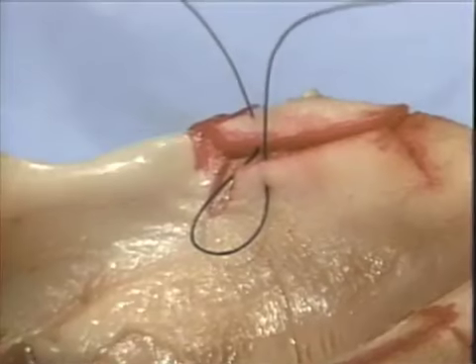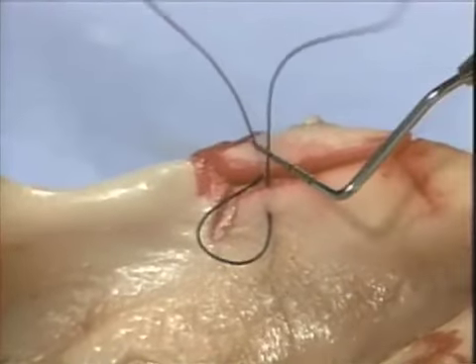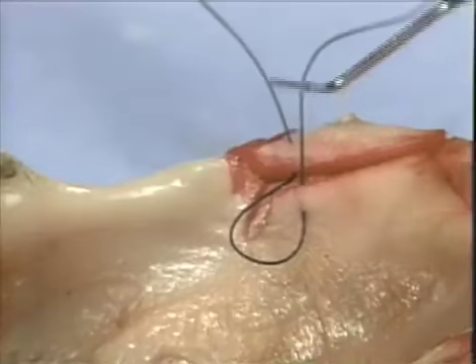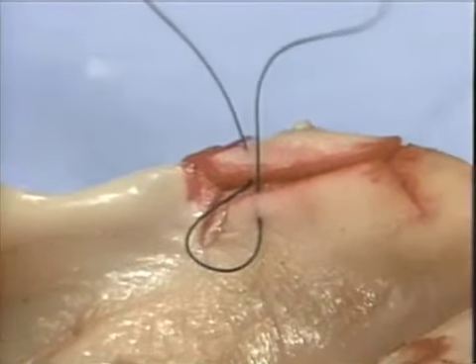What this technique results in is a portion of the suture passing through the incision both in a lingual direction and buccal direction, forming a figure-8. The crossover of the figure-8 occurs at the incision.